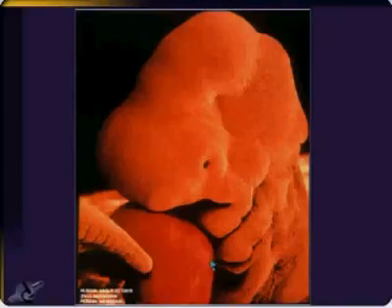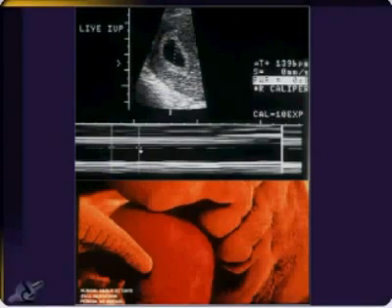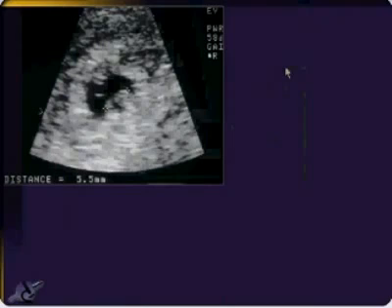And what you're actually seeing is that as this squeezes, that whole little embryo blips up and down. So you're actually seeing the whole little embryo move. And you can pick up things in there before you even see anything. Here we saw something blipping in there, nothing we could measure, but it's blipping at 139 beats per minute. So you know that's a living embryo in there.